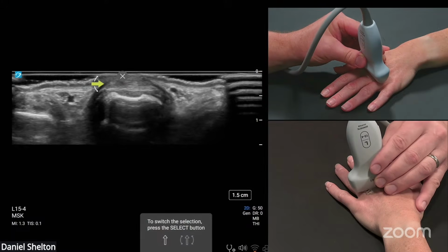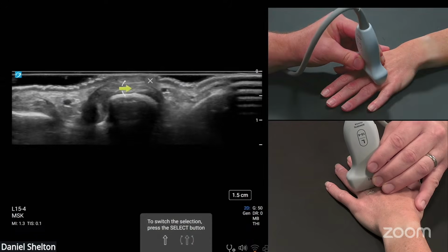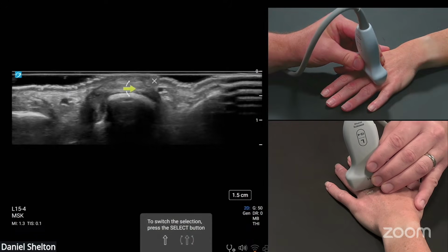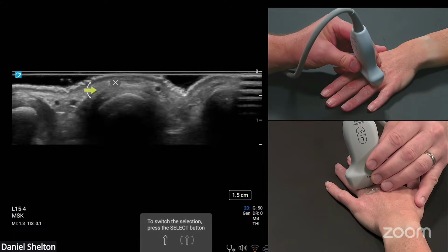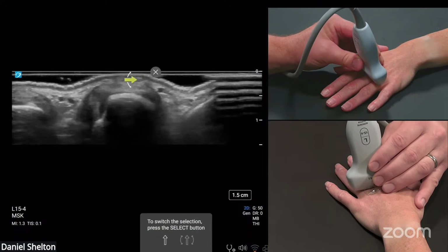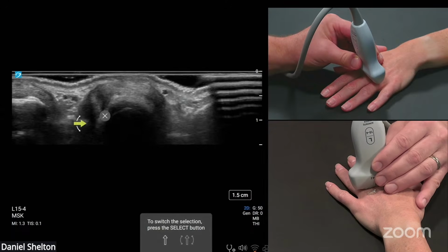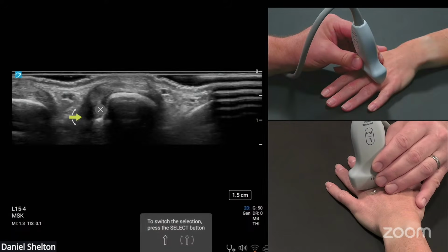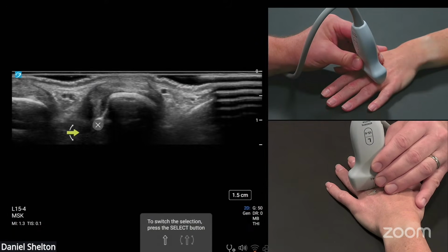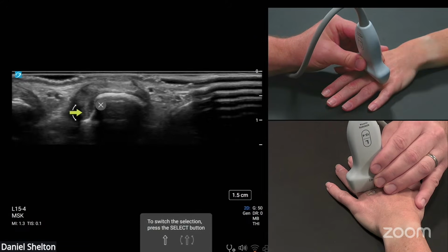We have two parts of the sagittal band. There's a superficial sagittal band that goes over the extensor tendon, and there's a deep sagittal band that goes below the extensor tendon and kind of acts like another sling or pulley on the dorsal part of the hand. Now that shadow on both sides does extend over the proximal phalanx a bit, but the sagittal band itself really stops at the joint. It does wrap around if you chase that shadow on the second digit, because we can curve all the way around. You can chase that shadow down to the intermetacarpal ligament level, where it will start to blend and taper in with the pulley mechanism on the volar hand and the volar plate.